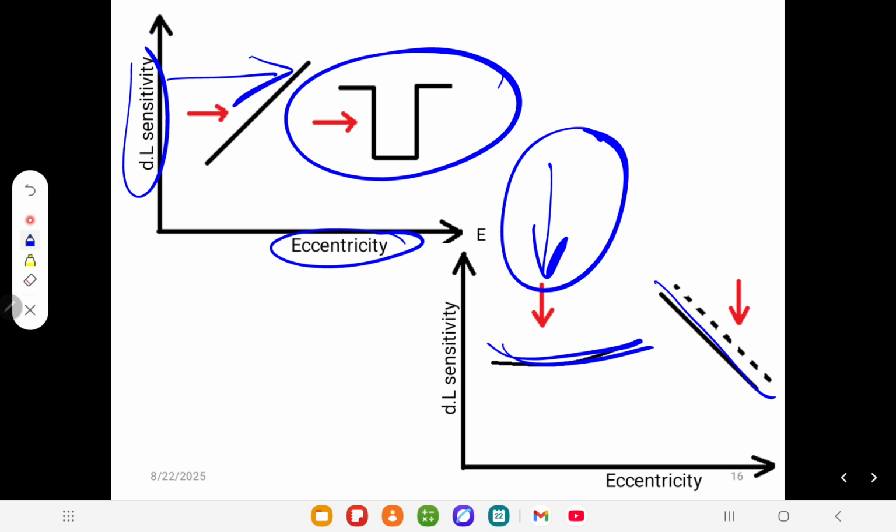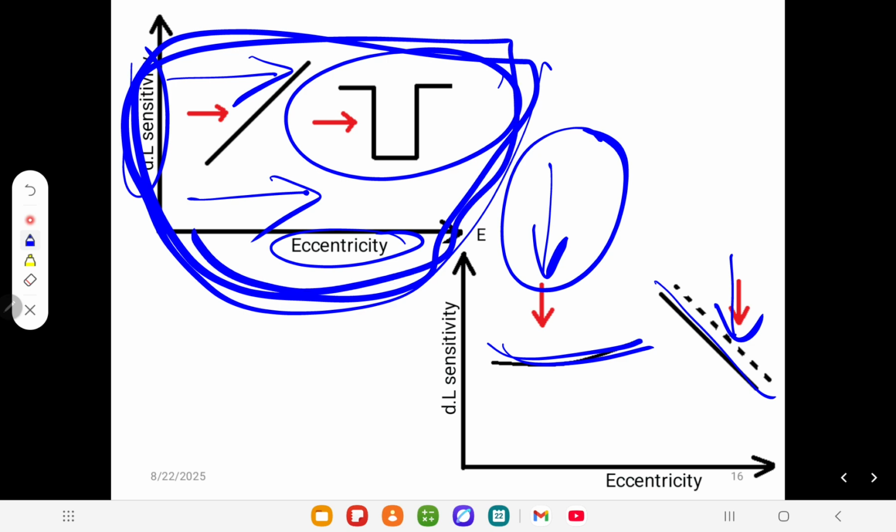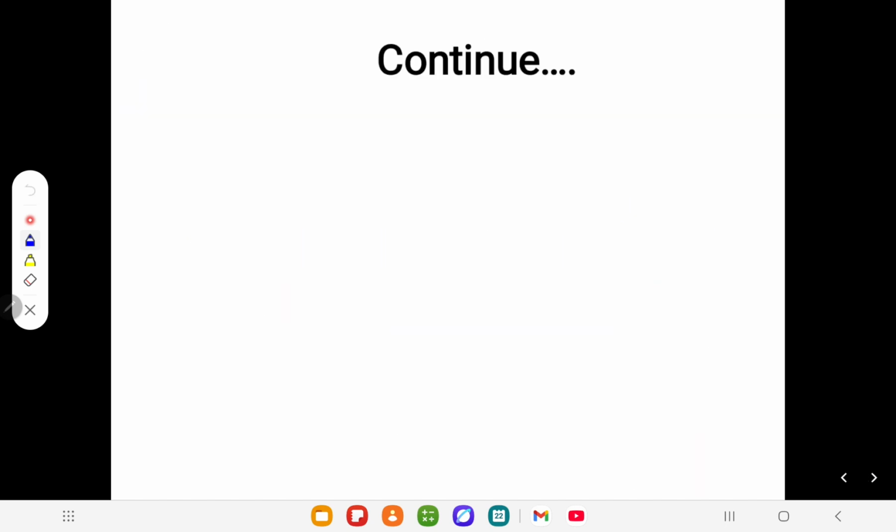Okay, small slopey differences, not steep differences. Sometimes in case of kinetic perimetry, we can miss the slope or shallow defect in the visual field. The above is the kinetic visual field, and below this is the static visual field. Okay, you can see this diagram and understand how these things work.